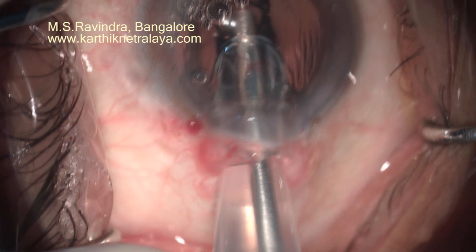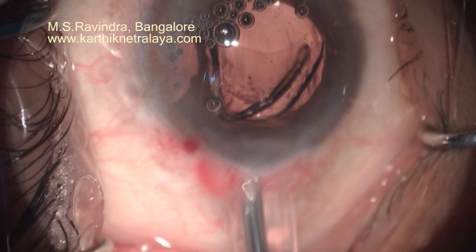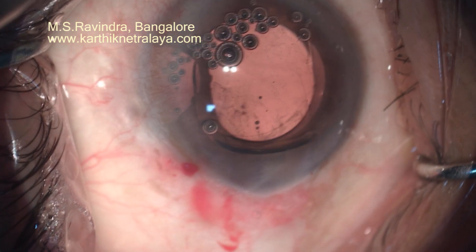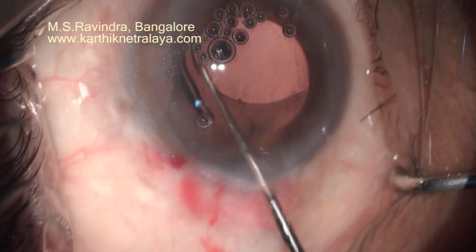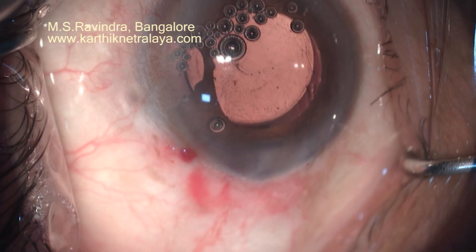The IOL is pushed into the eye through a slit cartridge. The cartridge is slit on top so that it opens up as the IOL goes inside. You don't need an injector — a 16-gauge rod is good enough to push the lens into the capsular bag.